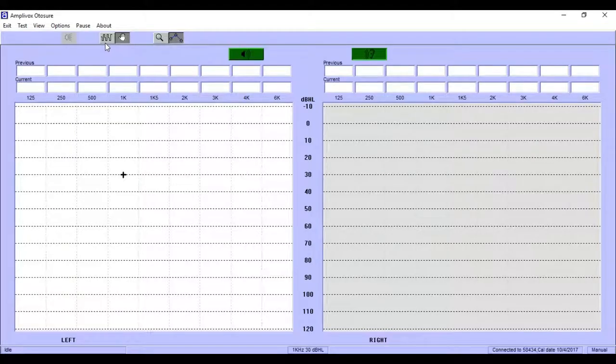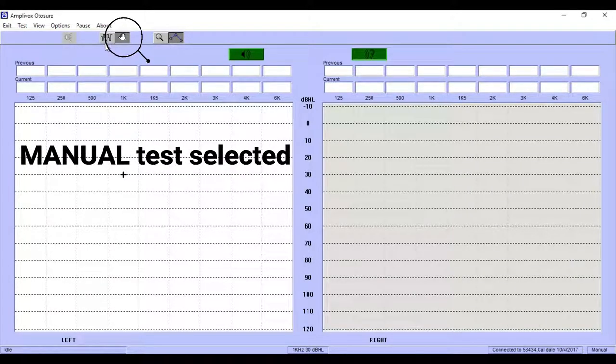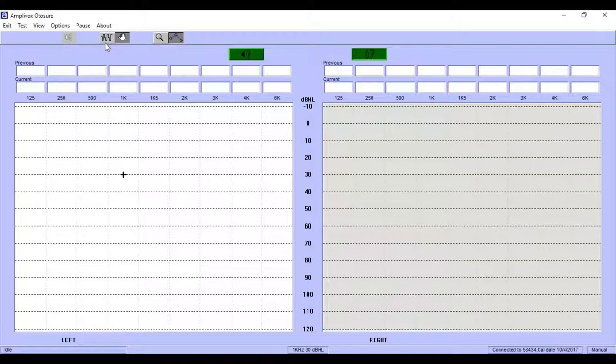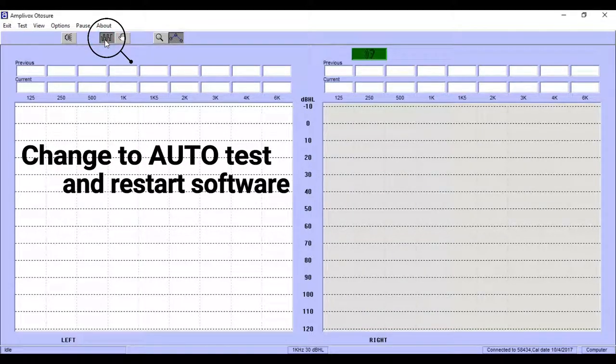Depending on your Audibase version, the module can be set to start in the manual test node. In this case, select auto start and restart the software so auto testing is chosen by default.